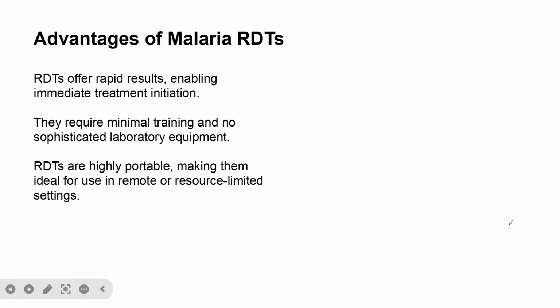So what I want you to understand, ladies and gentlemen, one of the advantages of the malaria RDT test is that it's actually very rapid, it is quick, and it requires minimal training and no sophisticated laboratory equipment is required, and then it is highly portable.